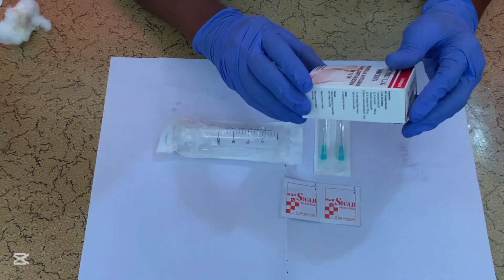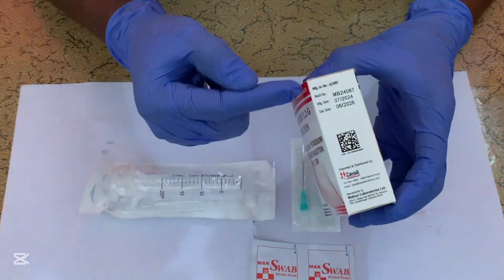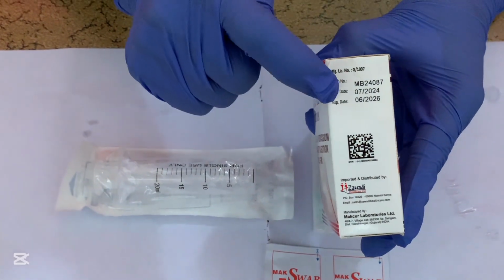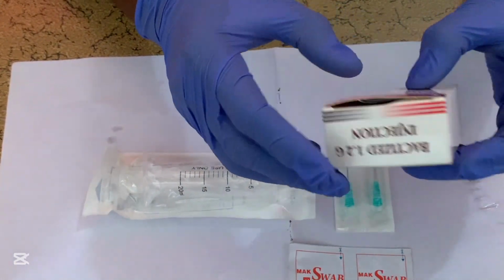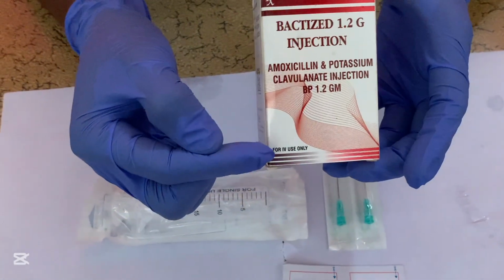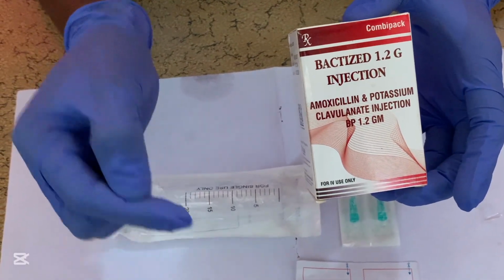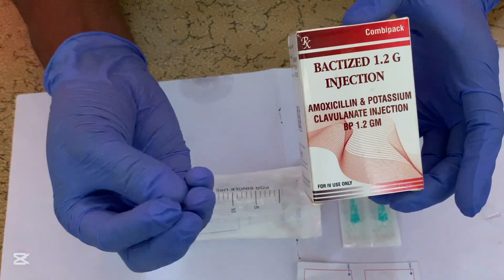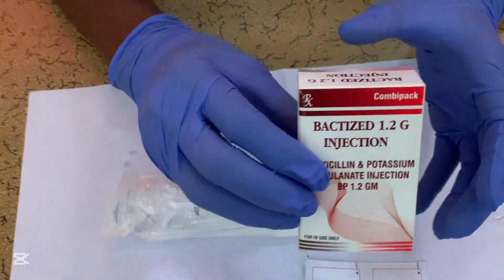Make sure that you check the labeling of the drug, that is the expiry date, which for instance is June 2026. Then also check the method of administration, that is for IV use only. In this case, you cannot administer through the IM route, but only through slow IV use or slow infusion.